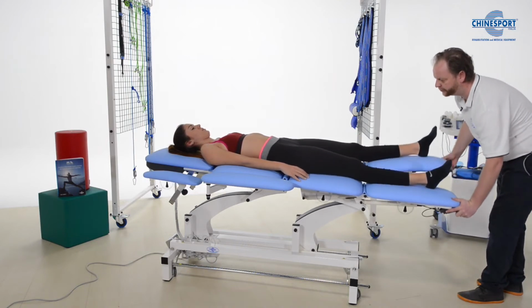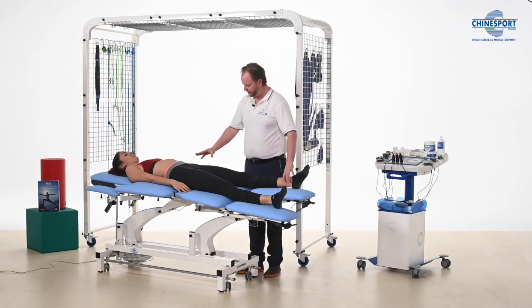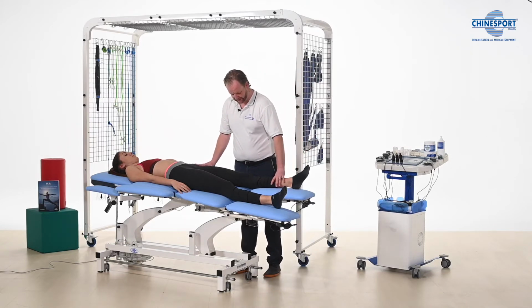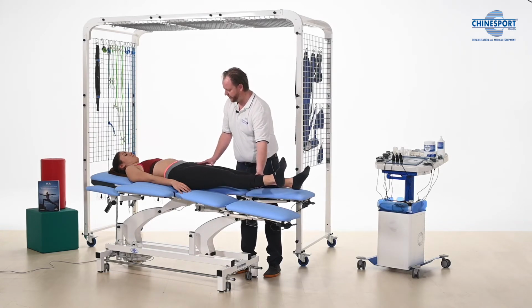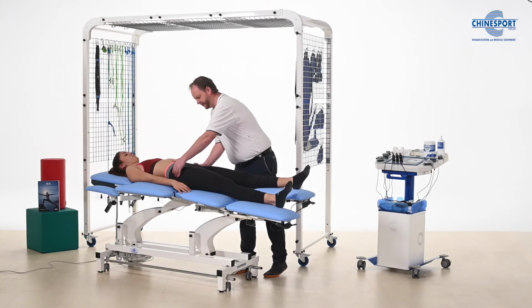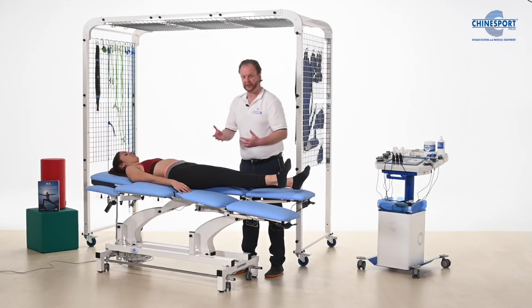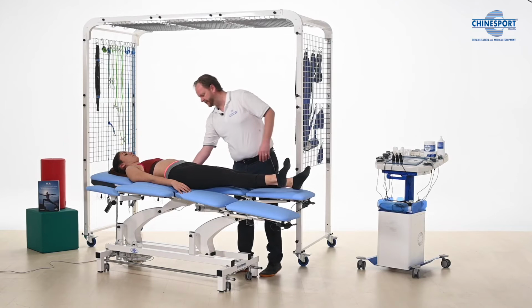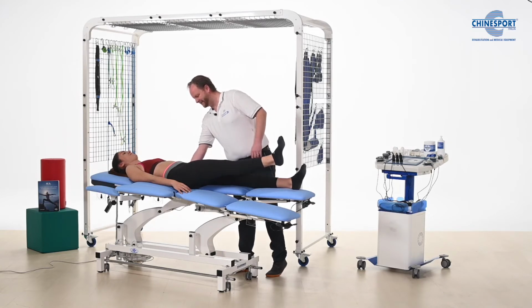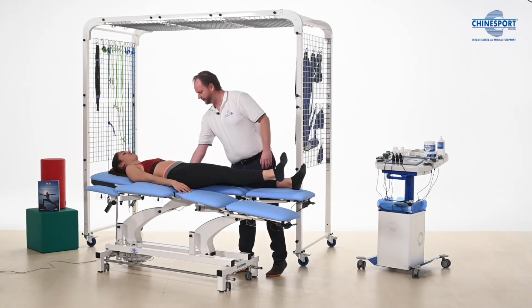Or what we can also do is we can start with some isometric contractions where she pushes this leg into the table and she lifts the other leg up, straight up, and tries to keep the pelvis really nice and straight. Lift up the leg, yeah, and just hold it there. And this is a nice way of doing some isometric exercises, some stabilization exercises for the spine. Just hold in here. That's it. Very good. Okay, perfect. Lower a little bit and hold, hold, hold, hold, and relax.